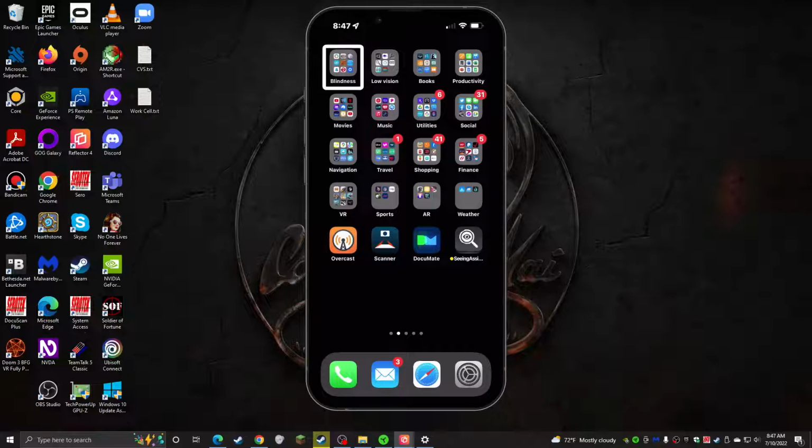So a lot of people just slap a picture of text into PDF files, which are not inherently accessible. PDFs can be natively accessible. There's some great ones, but a lot of people don't go that extra effort and make PDF files accessible. But if you share it to an app like Voice Dream Reader, its scanner feature can, like I said, OCR or pull the text out of those files to make them more accessible. And then you can read them visually clearer, you can read them audibly.